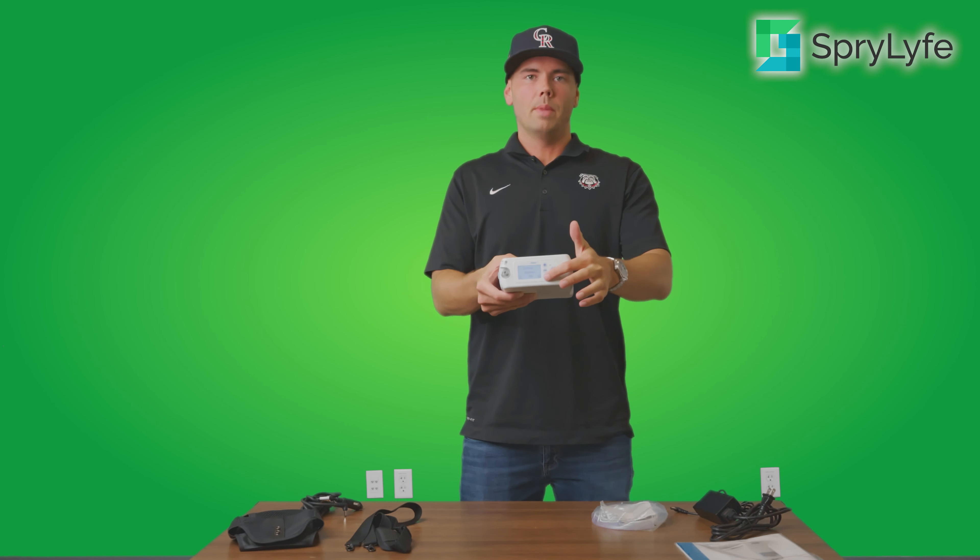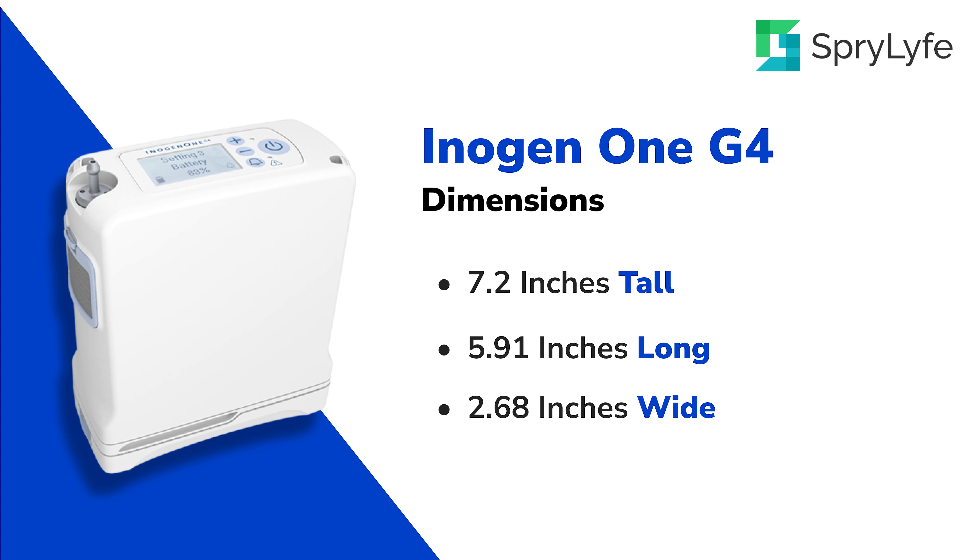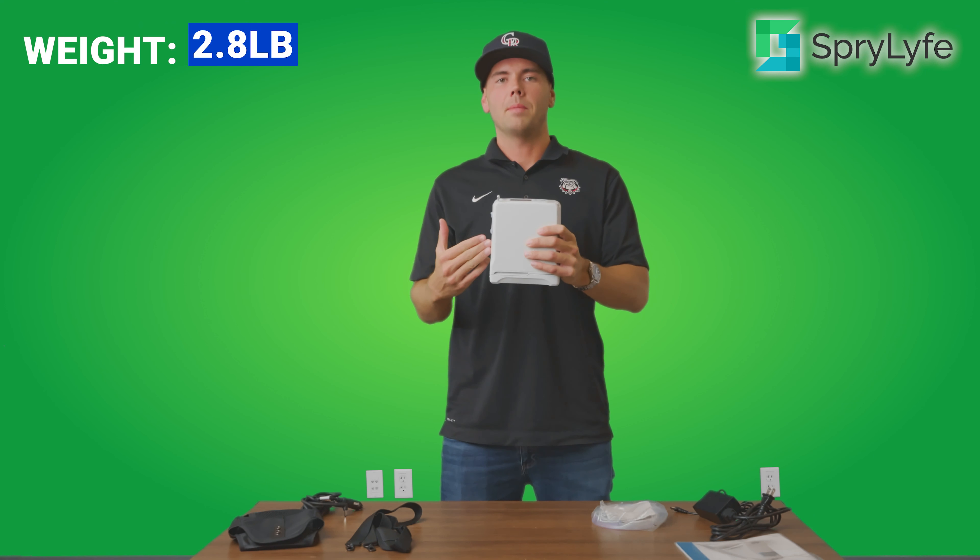To power the unit off, it's very straightforward — just hold down on the power button itself and the unit is turned off completely. The dimensions on the Inogen 1 G4: the height comes in at 7.2 inches, the length 5.91, the width 2.68, and it weighs in at just 2.8 pounds, so it's extremely lightweight and easy to carry.